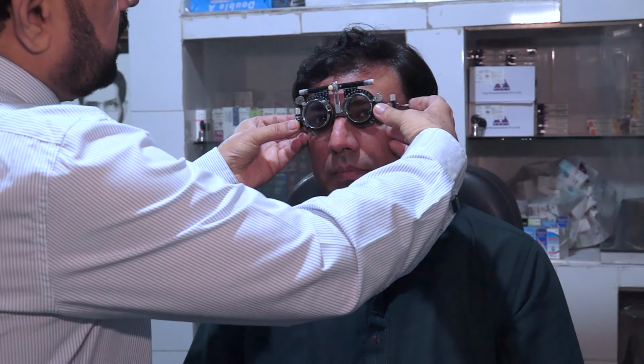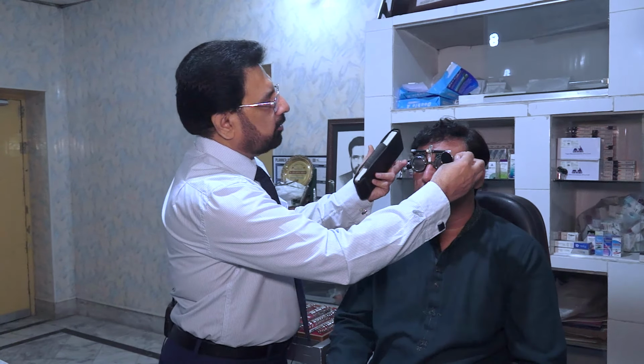Now we are going to do a subjective refraction of the patient. So this is called a trial lens frame. We have already performed an objective refraction of the patient on the refractometer, and we have taken the printout, and now we have put those lenses in the trial frame, and we are going to do a subjective refraction of the patient. So now we are going to occlude one eye with the occluder in the frame.